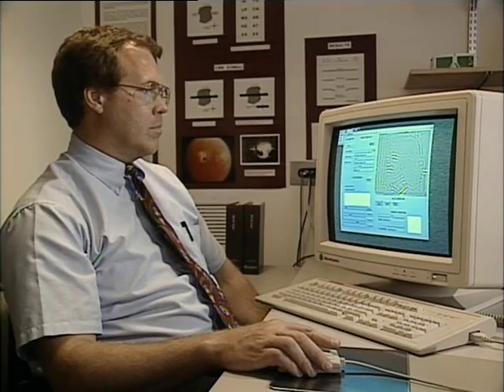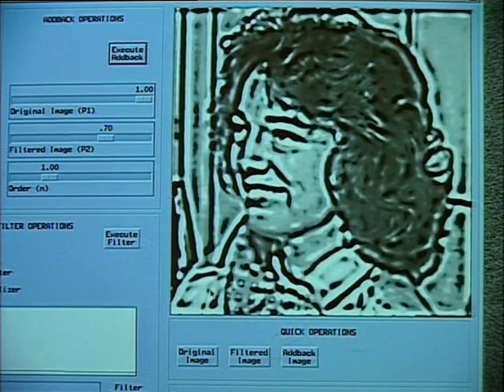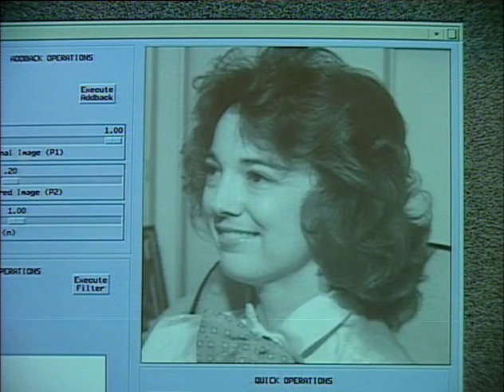But these same patients will tell you they can recognize caricatures. For example, we can all see right here this caricature of Bill Clinton comes through just fine, and that's because the details that define the face are heavy contrast. They're dark lines that outline the important features that make the face recognizable. So Bob is developing a computer program that can start with a TV picture of a face, then derive a high-contrast cartoon version. This is just the kind of processing that can be built right into the helmet's electronics. And it will happen in real time, too. The user could, say, scan around the table and instantly recognize everybody there.